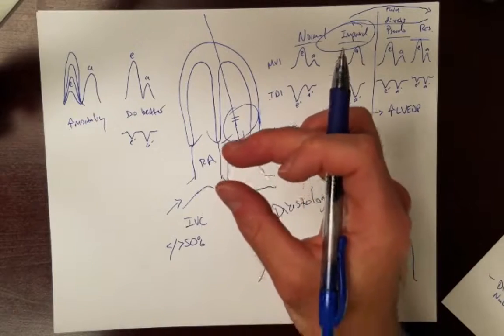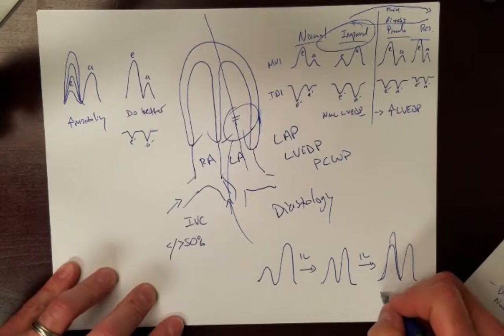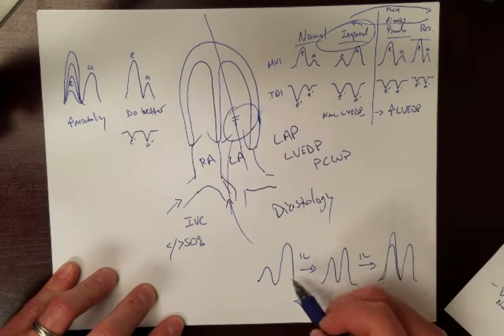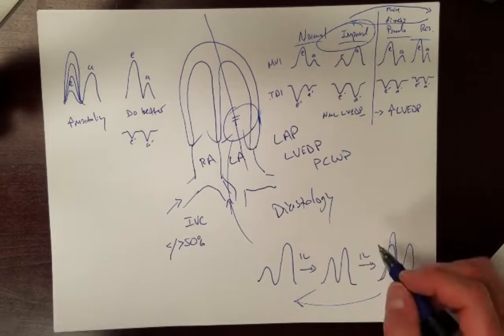Now keep in mind that as soon as you start that person on pressors, you might have to recheck this, and we might, with pressors, see them have a decrease in preload, and we have to do this process again and give them more fluid again, because this is a dynamic situation, right?